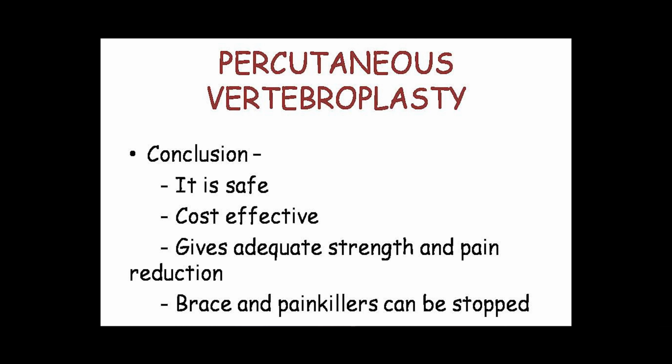adequate strength and pain reduction. And most importantly, you can avoid braces and painkillers, which will be your friend if you do not treat those vertebrae with vertebroplasty and if you just depend on painkillers and calcium. So this is an elegant technique for treatment of vertebral fractures, and we should not be wasting time in treating these patients when we encounter this sort of disease.